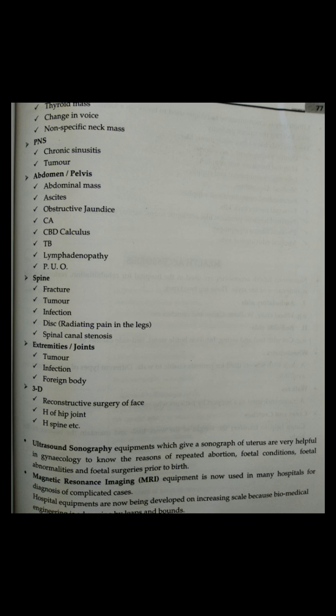Then next is lithotripsy. Lithotripsy is a non-invasive technique used to break up the kidney stone by laser beam after locating the calculi perfectly.